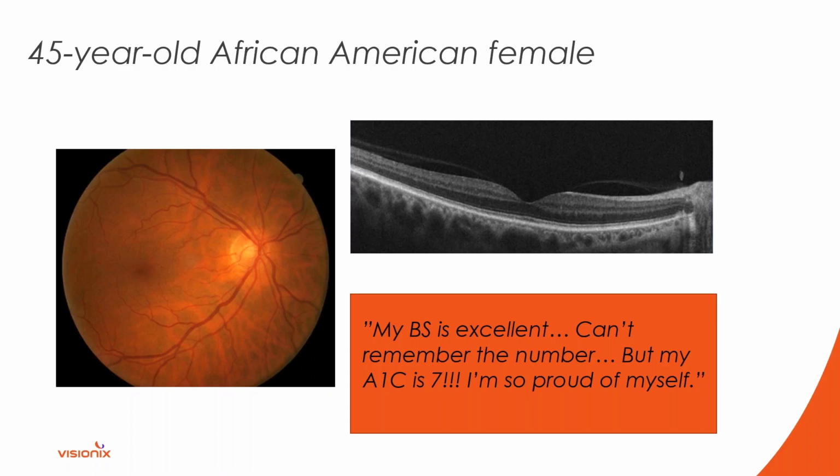I take a look at her retina. You can see the picture here, and pretty unimpressive, right? It looks good. She may have one little microaneurysm there. And her OCT B-scan looks uneventful except for some vitreomacular adhesion.